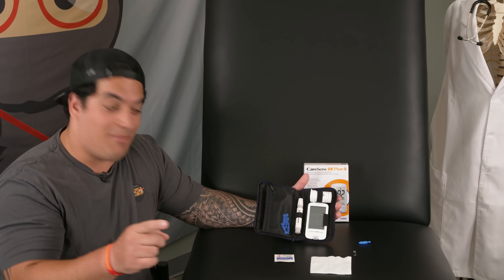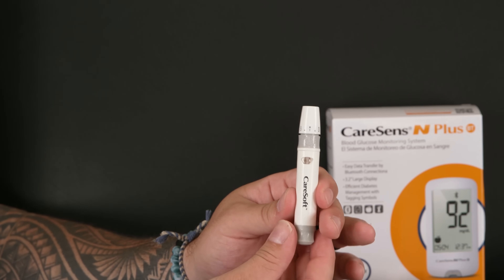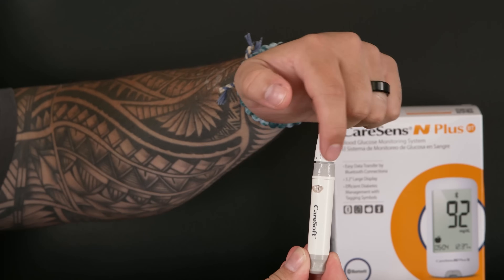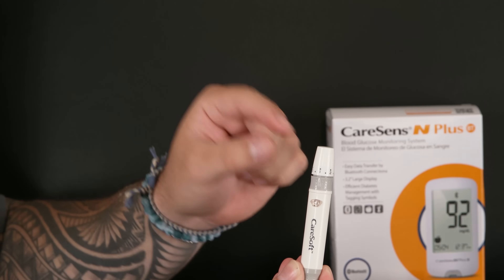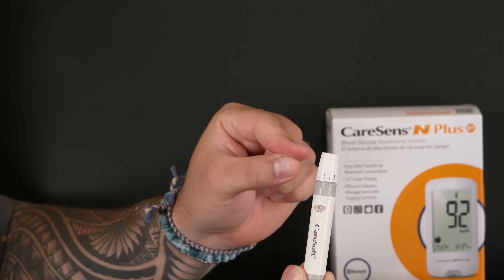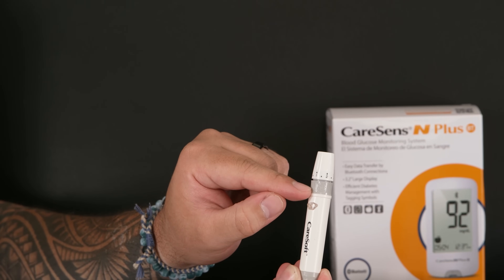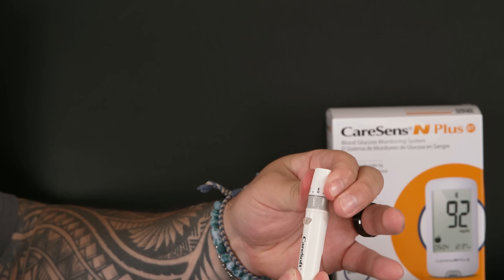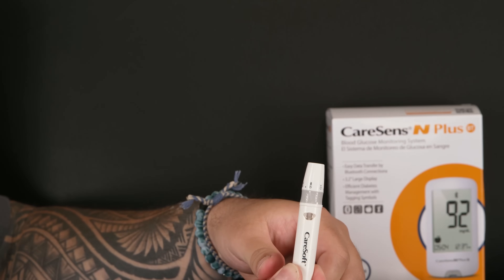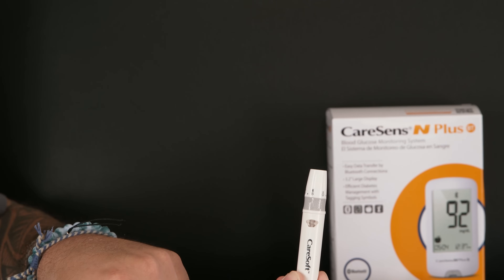Let's take a look at the lancet device. You'll see numbers across the top — zero, one, two, three, all the way up to five. This determines how deep the needle will plunge into the skin. For thin-skinned individuals, a lower number like one would be appropriate. For someone like me with thicker skin, a higher number like five would be needed. The indicator on the device shows you which depth setting you're on.